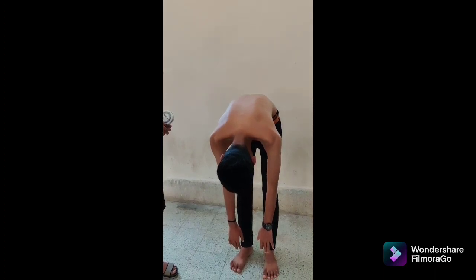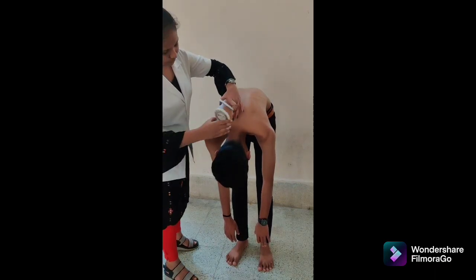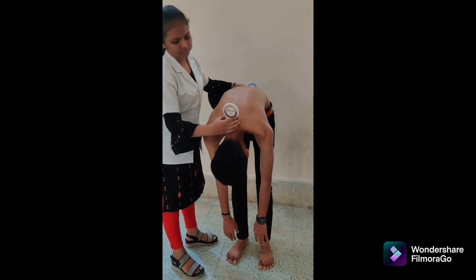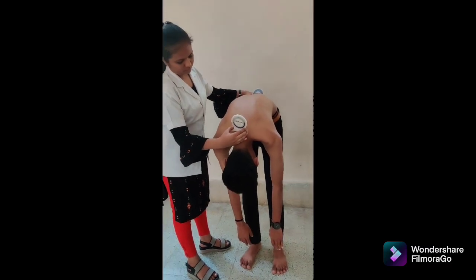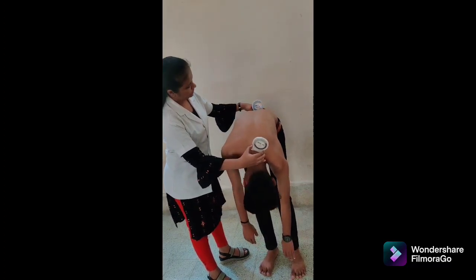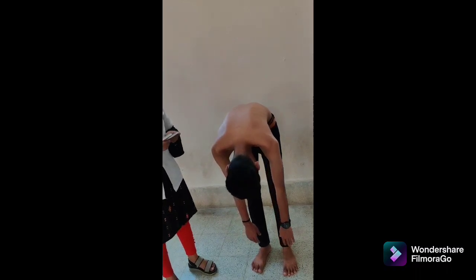We are going to perform thoracolumbar rotation with double inclinometer. Patient position: forward flex standing position with back parallel to the floor. Inclinometer alignment: place one inclinometer over the spinous process of T1 and the second over S2, both adjusted to 0 degrees. Instruction: rotate the trunk as far as possible without moving into extension. Examiner holds the inclinometers against the back during the motion. Note the degrees indicated at the end of the motion. The difference between the two inclinometer readings is the rotation range of motion.